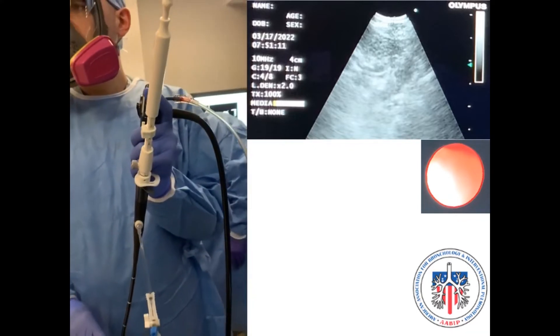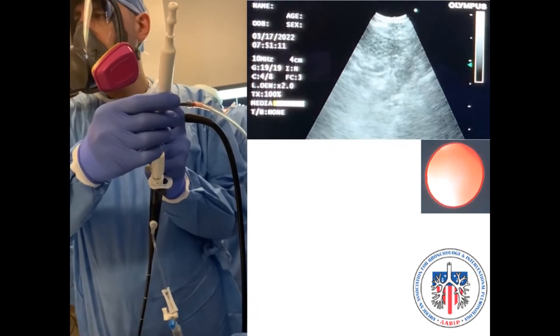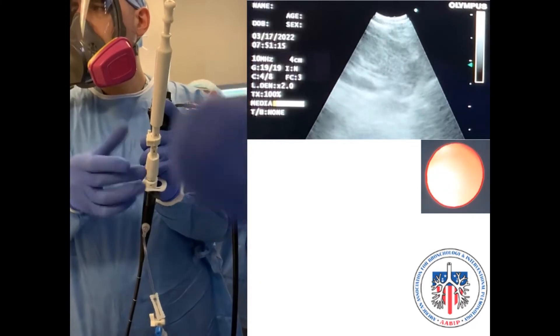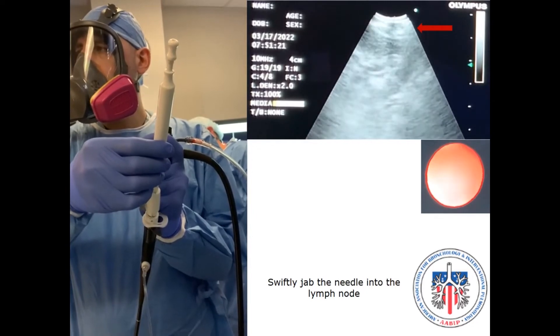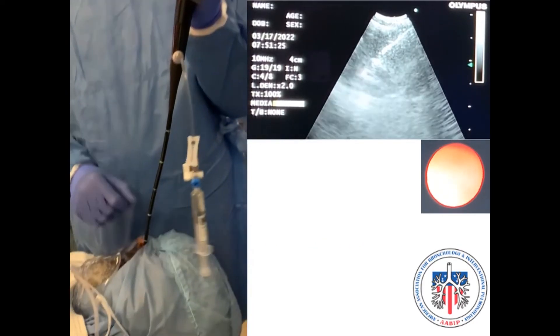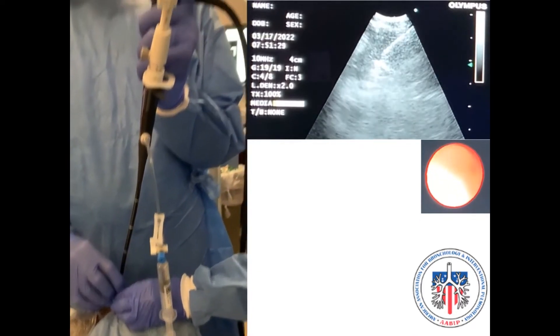In this case, the lever was positioned at the 2 centimeter mark. Maintain the scope in a steady position. When ready, quickly jab the needle down.